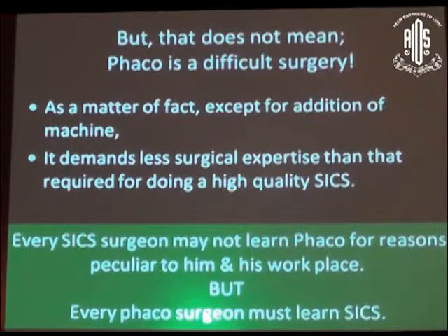Our SICS requires some expertise. And I must say that every SICS surgeon may not learn phaco for reasons peculiar to him or his workplace. Maybe a guy is working in a government setup, where the government is not going to provide consumables all the time. You need to change the phaco tubing and tip, and the consumables are not provided by the government. Or he is aging, he is 65 years and he is happy and comfortable with the SICS. No problems. But I must say that every phaco surgeon must learn SICS.